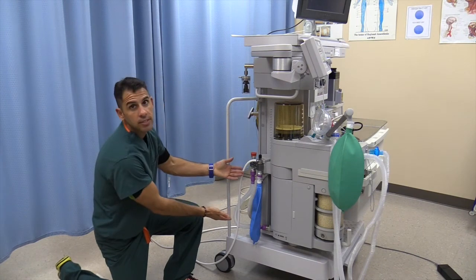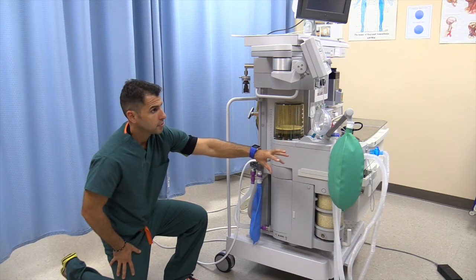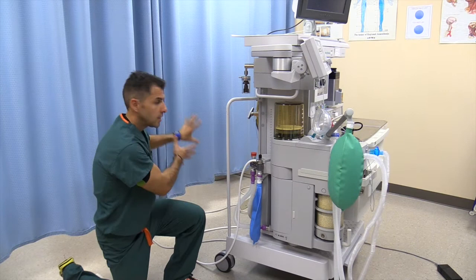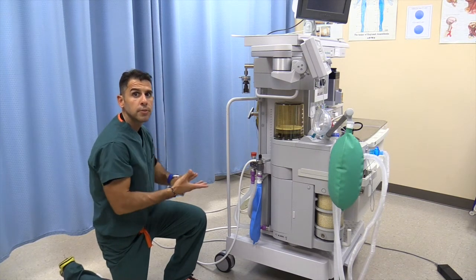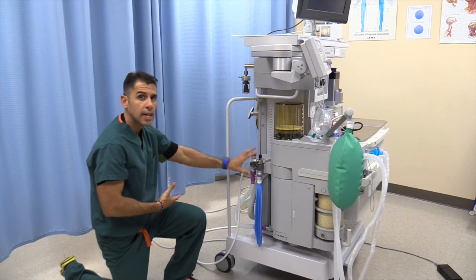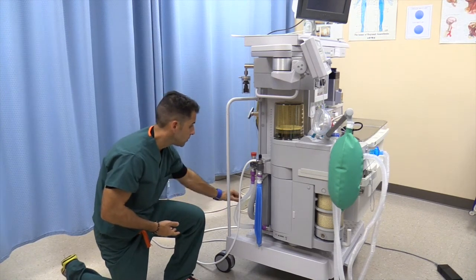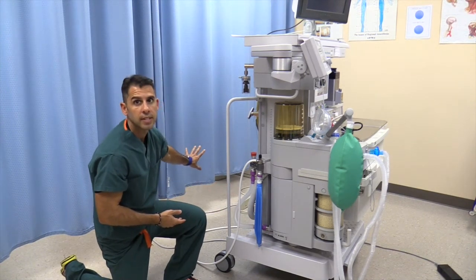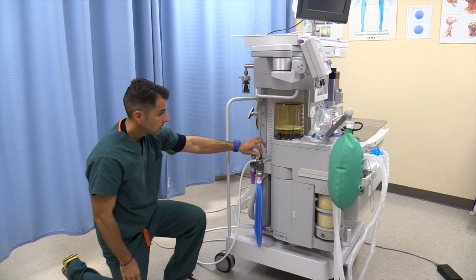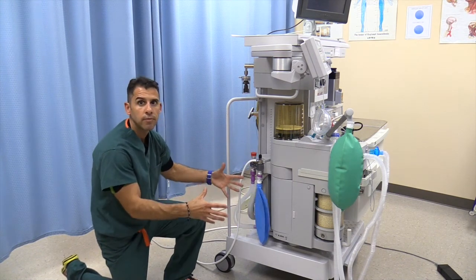The anesthesia scavenging system takes the expired anesthetic gases away from the room. If your hospital has a wall suction system, the gases go through that. In office surgery, there will just be a tube that diverts the anesthetic gases away from the room and out to the ambient air. You can adjust your scavenging system, and you will see the bag inflate and deflate as the patient expires.